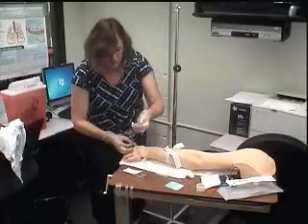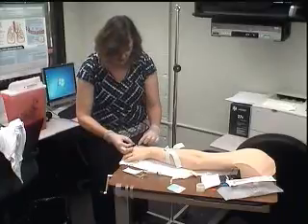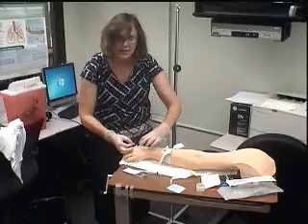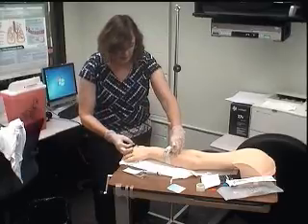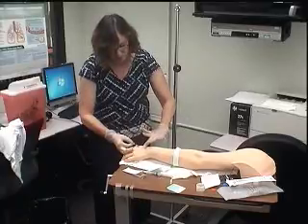Okay. Before I go and do anything else, I've got blood starting to flow into this. I'm going to pop the tourniquet off, because I don't need this to be a big juicy vein anymore. It's in there. Blood is coming everywhere if I don't do something. So I'm going to pop this off, and then I'm going to put some pressure above where the catheter is.